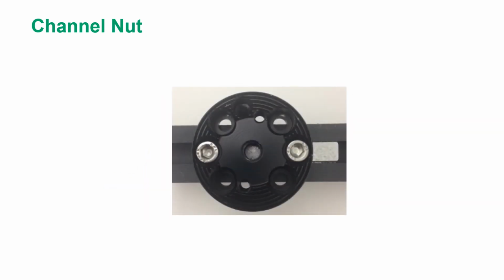The channel nut inner piece has bolts and a single T-nut that, when aligned, slide into the single track of the wheelchair and are tightened into position. The channel nut frame clamp is only used for single groove track wheelchairs. It is very important to have the wheelchair make and model and the pictures of the actual chair, as not all tracks are made the same and may require a different T-nut.